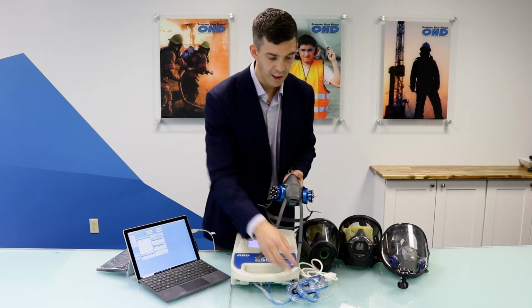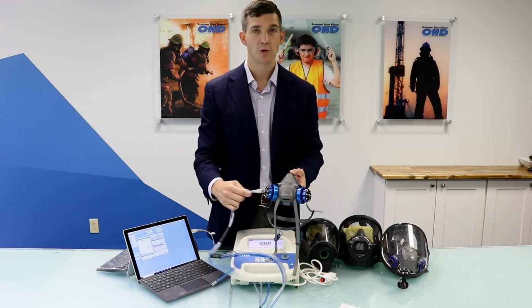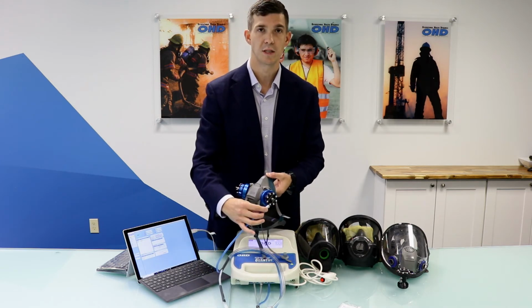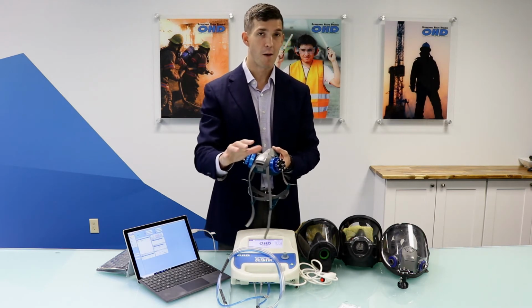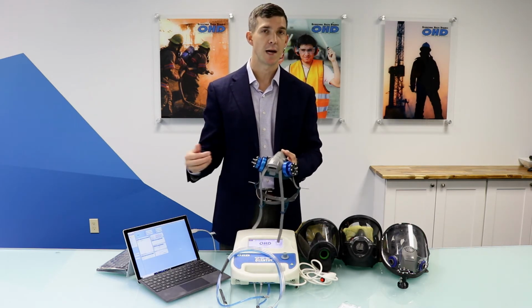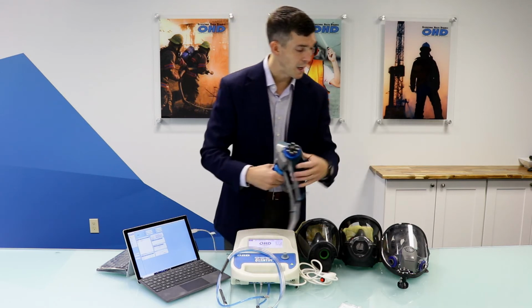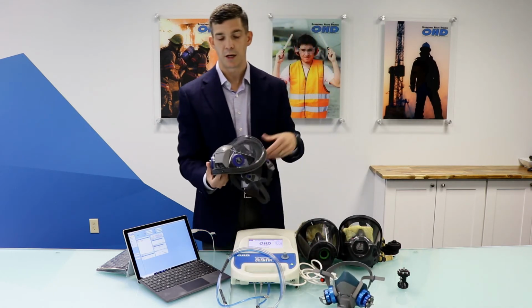The dual tube connection, which we were talking about earlier, the two clear tubes would come to your dual tube side, and then your single blue tube connector would go to the single side. Again, if you have anything crossed over, that's a problem when you're doing fit testing. It should be very nice and clean every time you're doing fit testing there. So let me now show you a similar connection point, but in an industrial full face.